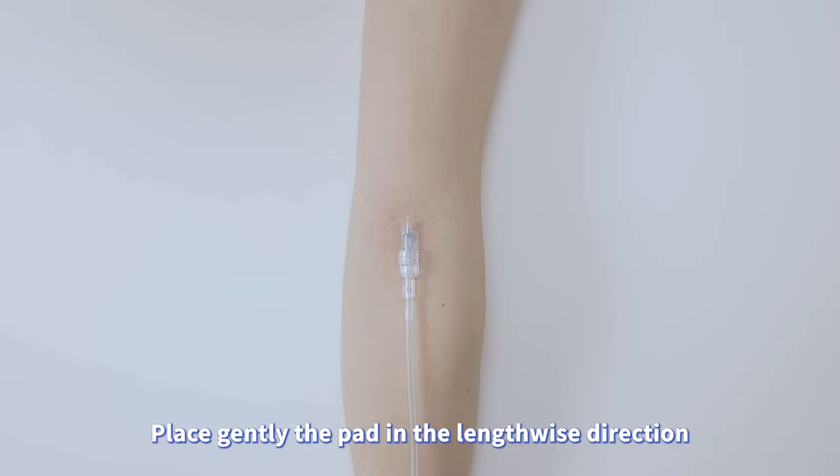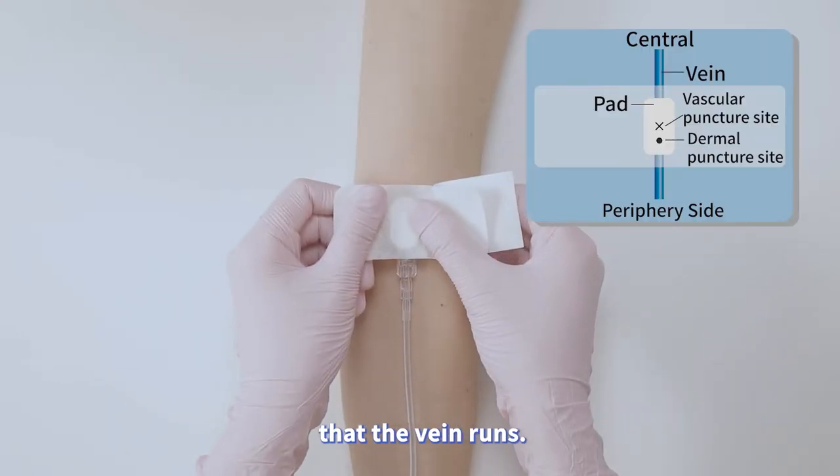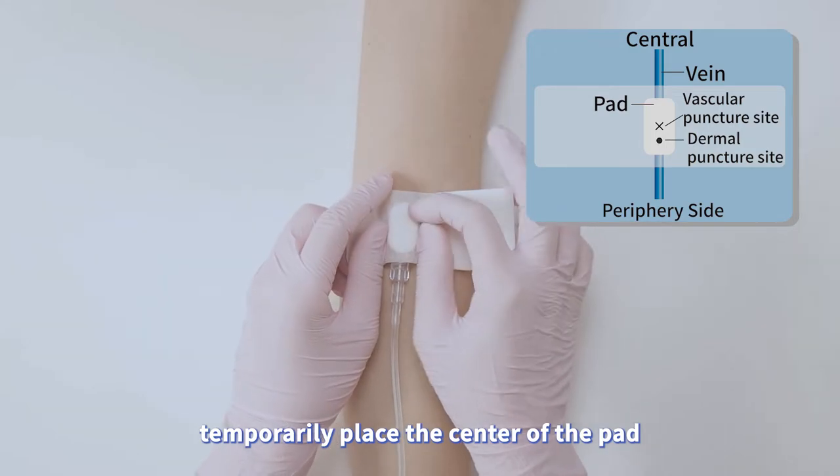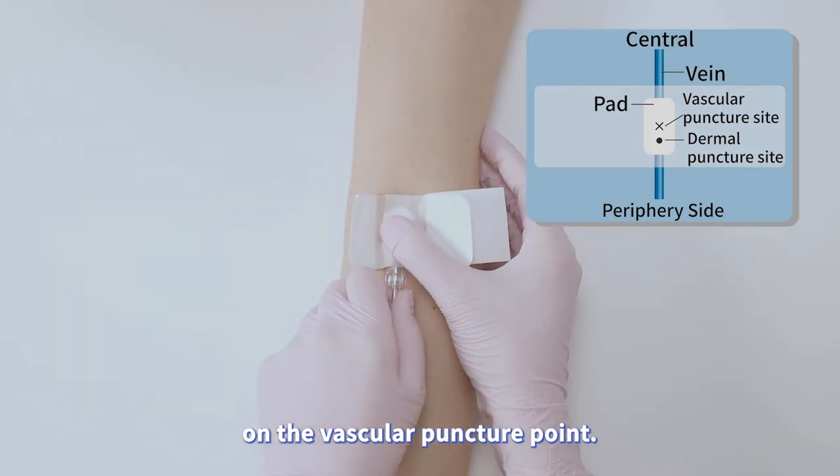Place gently the pad in the lengthwise direction that the vein runs, before removing the needle or catheter. Temporarily place the center of the pad on the vascular puncture point.